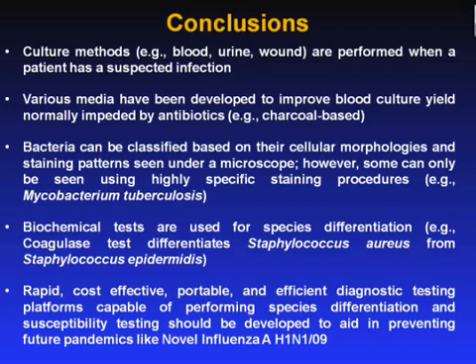There is a need for flexible, adaptable, and affordable point-of-care technologies that can detect a wide variety of infections. For example, the current novel H1N1 pandemic has demonstrated a need for suitable detection platforms for future pandemic threats and antiviral drug-resistant strains. In conclusion, rapid and highly sensitive and specific multiplex point-of-care nucleic acid recognition assays represent the future for diagnostic testing.